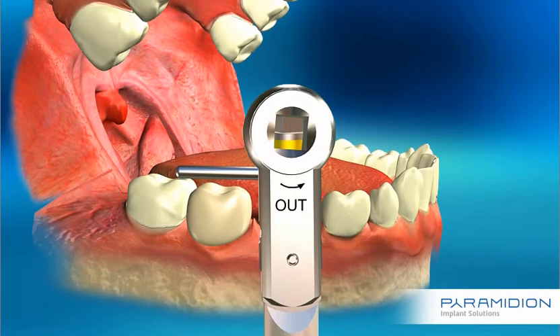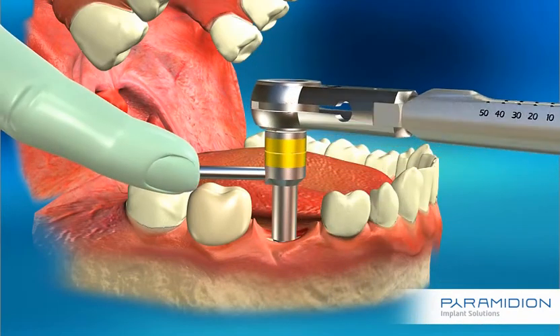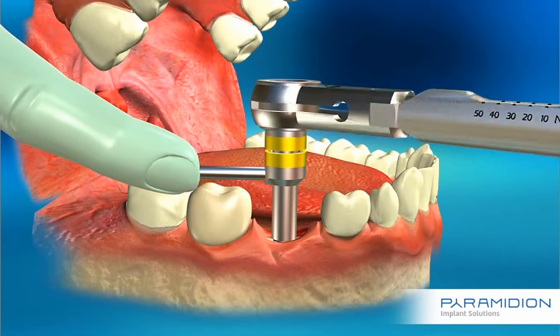Now it's time to remove the expansion tool. Holding the short handle with your finger, disconnect the expansion tool from the implant using the other side of the torque ratchet.